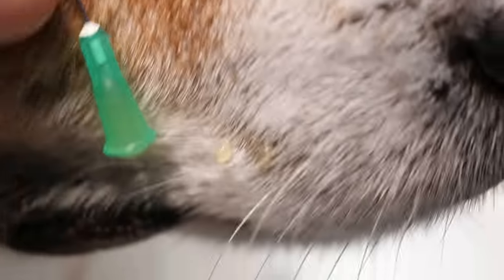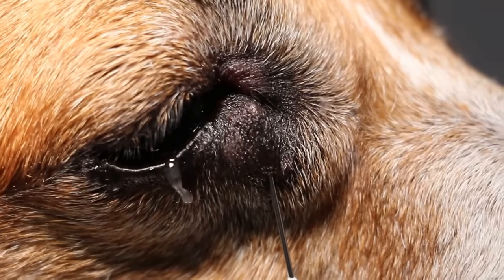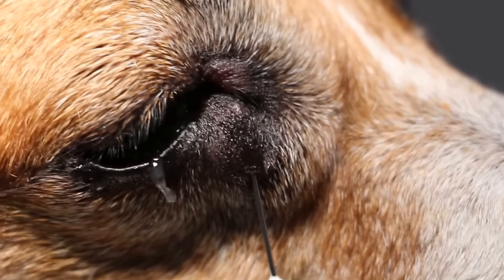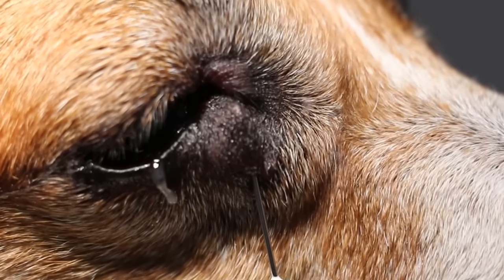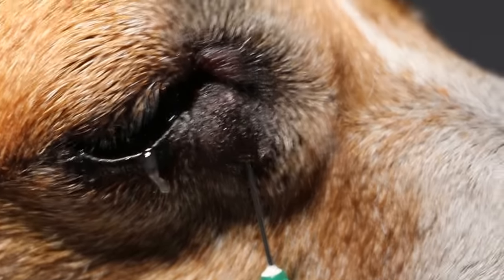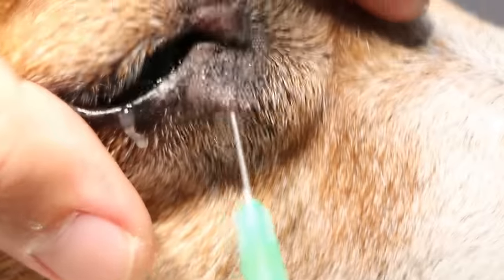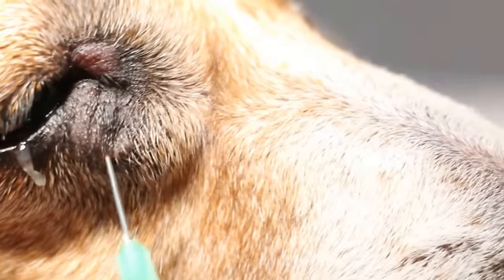It's gone down much. So it looks really much like a cyst. The last time I operated, 4 years ago, it was something like this but it was further down and it was an abscess. So now we do it again — we check and suck out everything, as much as we can.